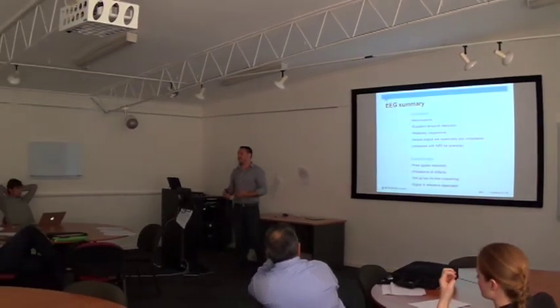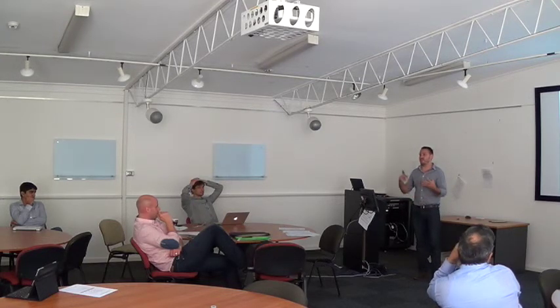Yeah, I'll put up that graph again. It's a heuristic, so they generally match up, but you can get changes in these different frequencies with tasks that you don't necessarily expect. What happens in the literature a lot is people focus on one frequency band and ignore the others. They generally do see changes in them, they just don't focus on them. So they happen, but it's a very complex interplay. You can think about this in a linear sense, in terms of gamma influences gamma. When you start thinking about it in a non-linear sense, the number of possibilities becomes massive. So I think that's probably why most people focus down into specifics.